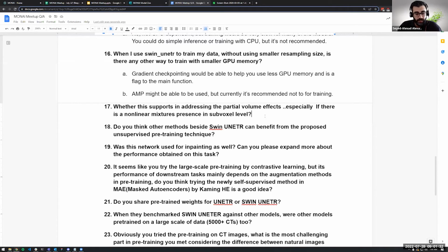I would say the way to maybe deal with subvoxel level effects or partial volume effects is something that you can do, for example, in Slicer, and that I like to do, which is to create a surface model out of the segmentation and smooth this a little bit. That's one way to deal with this, to create basically contours that cross voxels in a diagonal manner, for example, in order to partially deal with this.